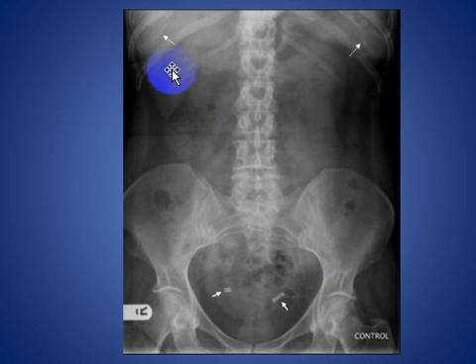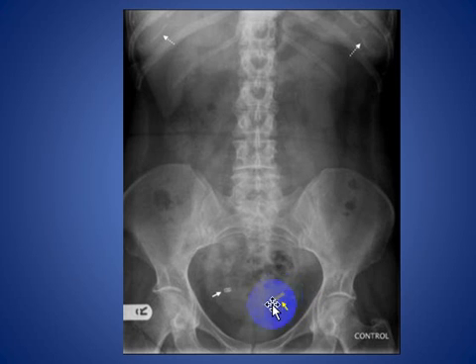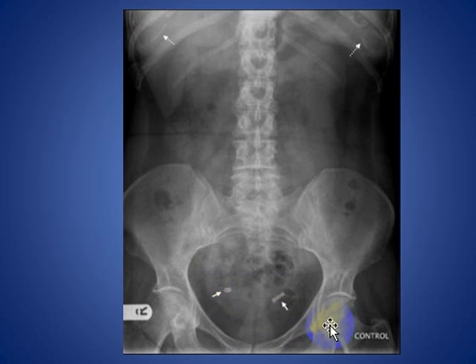Here you see costal cartilage calcification in a female patient, and there are bilateral tubal ligation clips seen in the pelvis, indicated by the arrows.